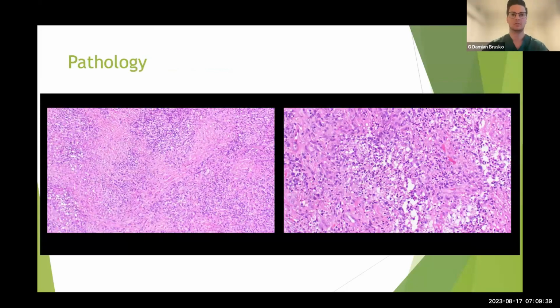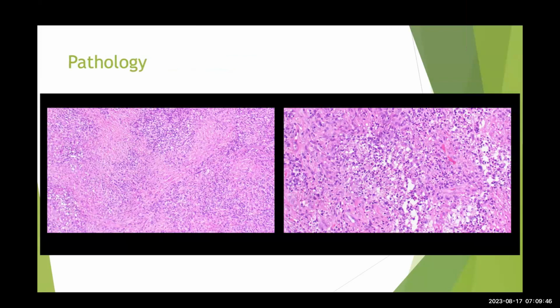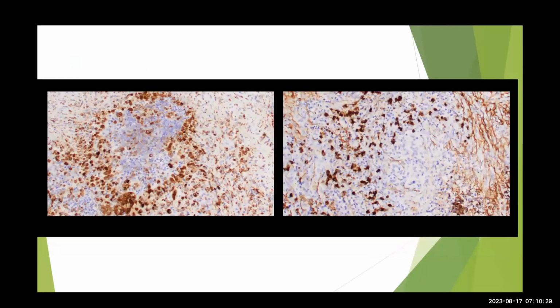Dr. Gultekin, are you hearing me? Yes. Okay, great. So you're looking at two images here. On the left side, I gave you an overview of a patchy involvement of the connective tissue. The connective tissue is pink, and the clusters of cells that you see here turn out to be, on the right image, necrotizing granulomas. In the center of the right image, you see individual cells that are undergoing apoptosis, necrosis, and it is surrounded by an array of viable cells. Next slide, which turn out to be histiocytes by CD68 staining.